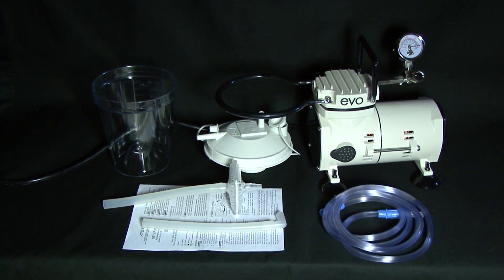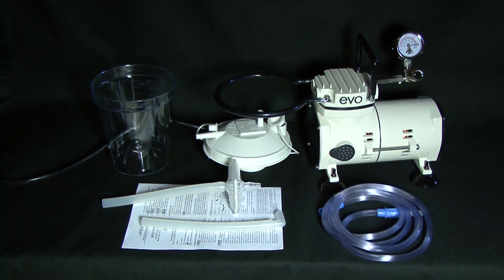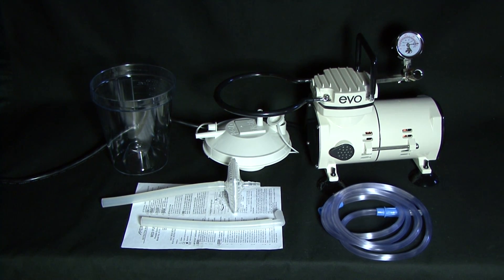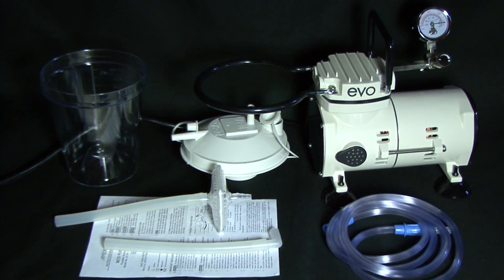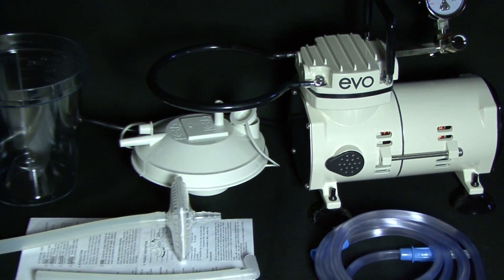In the box, you will find the AC-powered aspirator unit, an 800cc suction canister, 6 feet of connection tubing, a hydrophobic air filter with tubing, and an instruction manual.